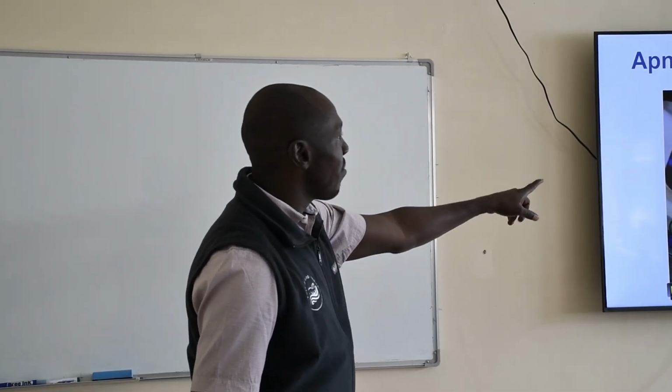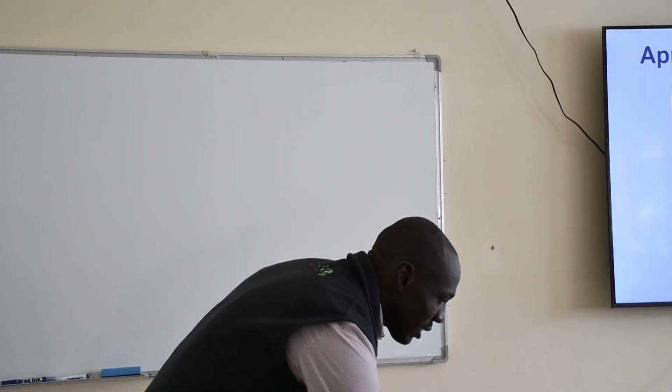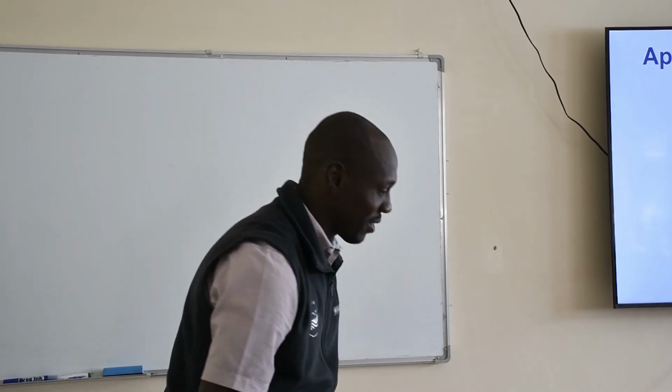So, this is the same baby that has apnea of prematurity. So, let's start this baby on CPAP.